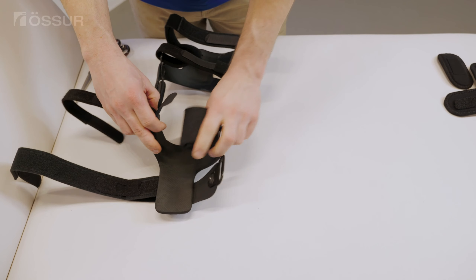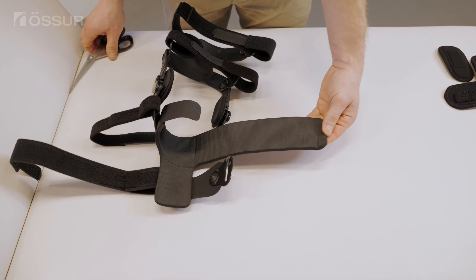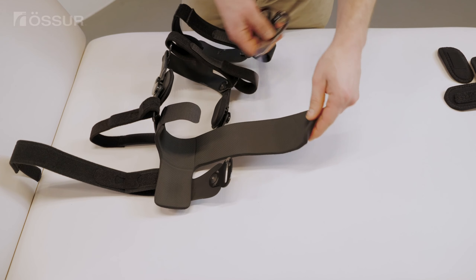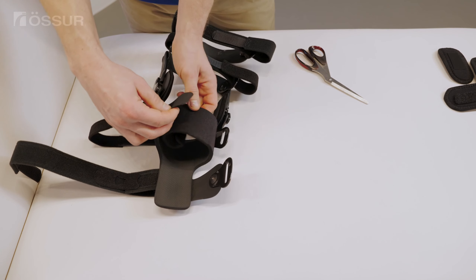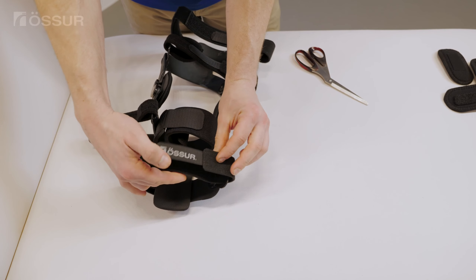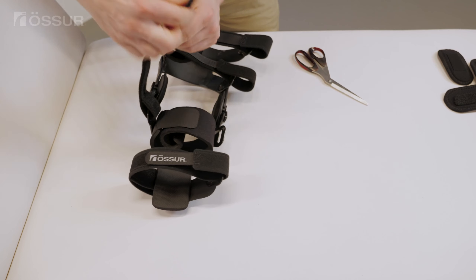If the wrap extension is too long, mark the location where you want to cut. Remove the brace and trim the extension at the marked location. Make sure that the wrap extension does not come into contact with the wrap, creating an overlap. Keep 0.4 inches or 1 centimeter space between the wrap and the wrap extension.